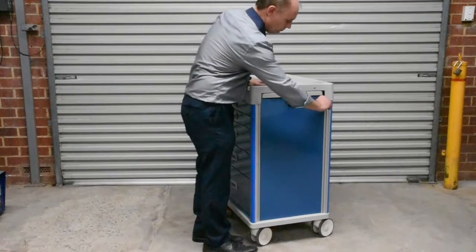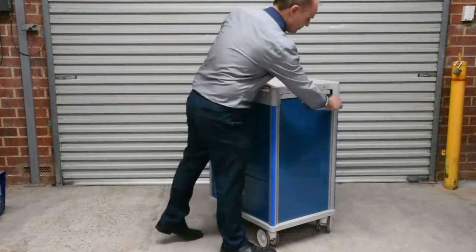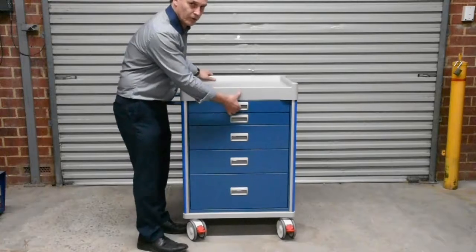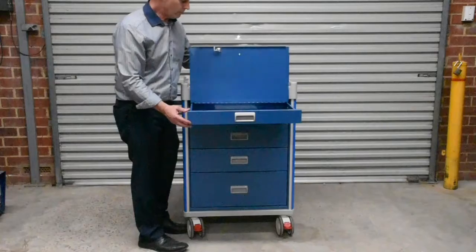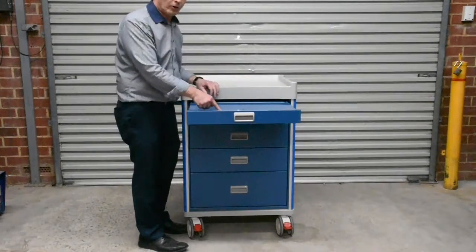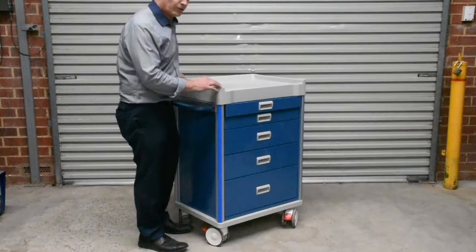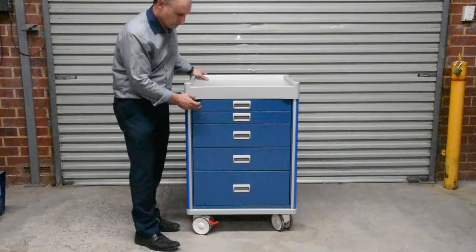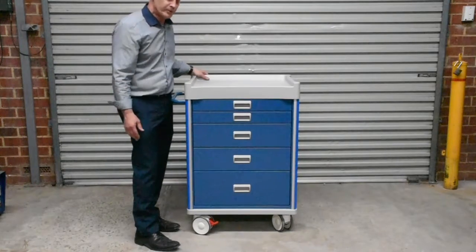All the drawers are lockable by a central locking key. The top drawer is also a drugs drawer, so it opens up like that and it's lockable with a key. All of them have got soft closure. We've got five drawers: seven and a half centimetres for these two, 15 and a half for these two, and 23 and a half centimetres high for this one.